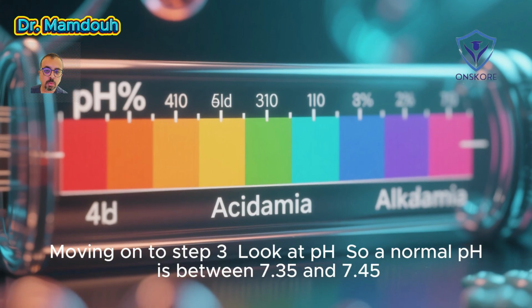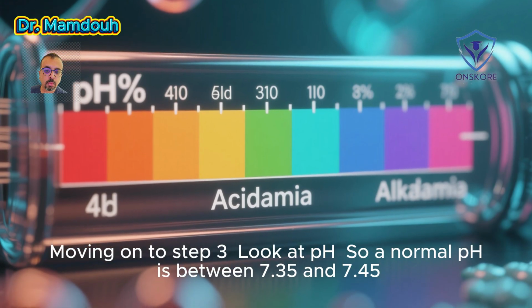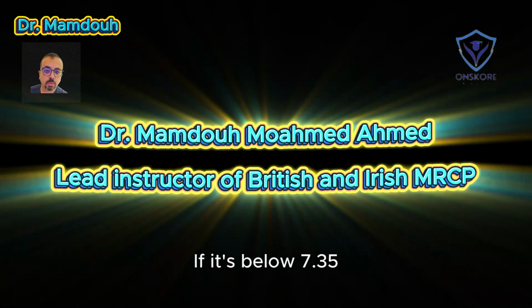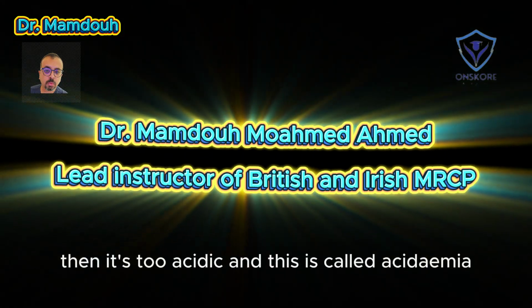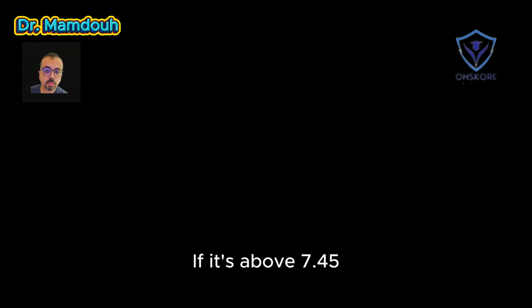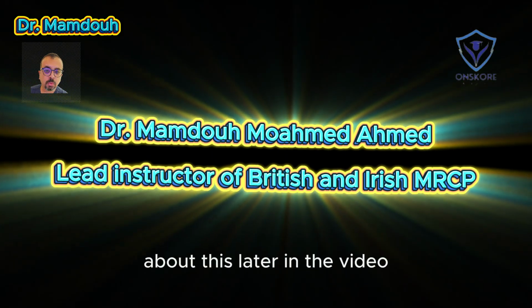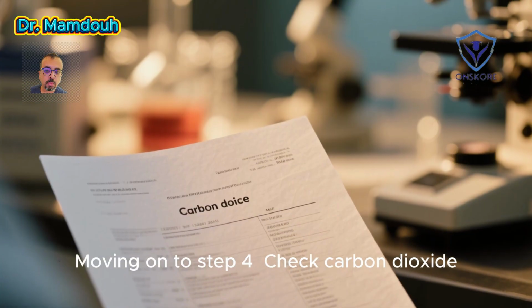Moving on to step 3, look at pH. So a normal pH is between 7.35 and 7.45. If it's below 7.35, then it's too acidic, and this is called acidemia. If it's above 7.45, then it's too alkaline, and this is called alkalemia. Now both of these can be caused by a number of different problems, and we'll talk more about this later in the video.